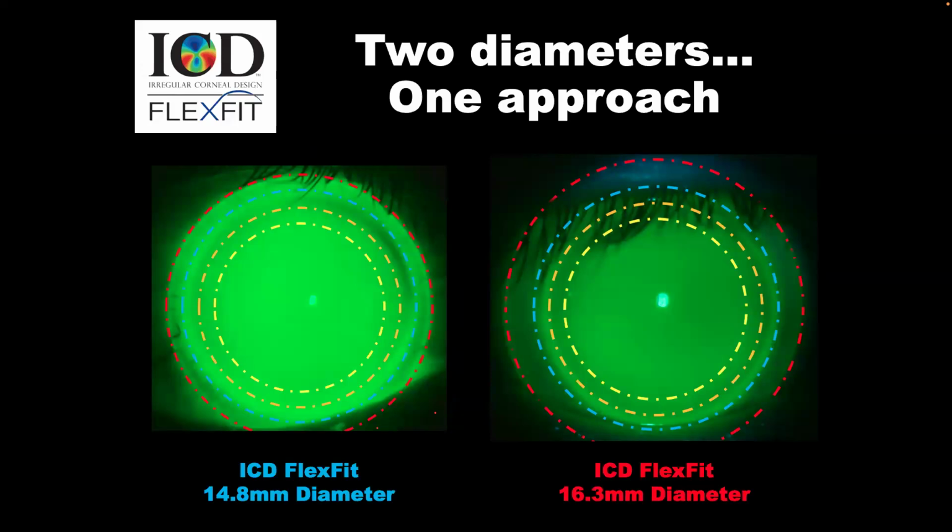So again, 2 diameters, one approach, trying to make the patient as comfortable as possible. I go by 3 rules: the patient being comfortable, having good quality VA, and quantity. Because remember, these patients mainly come from low visual acuity, and just gaining that little can mean a lot.